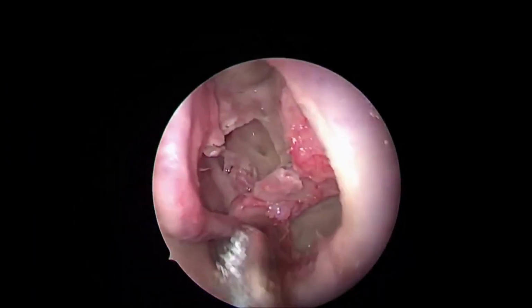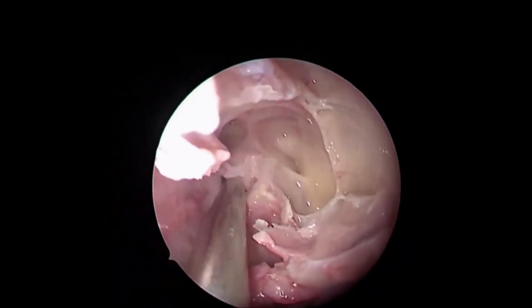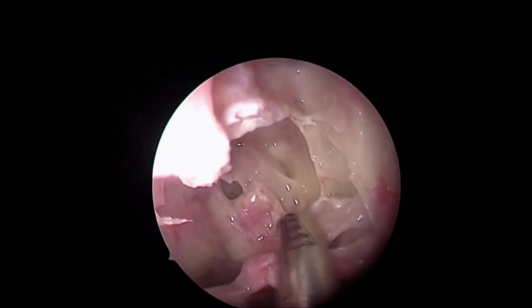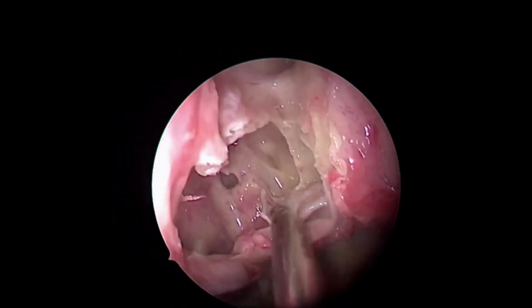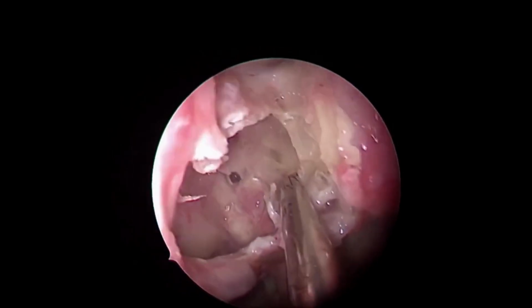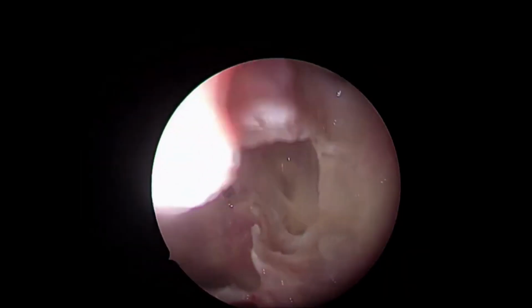Can you show us the frontoethmoidal crest, where exactly it is? Pardon? Frontoethmoidal crest in this specimen. Frontoethmoid, what is this terminology, boss? Can you elaborate? Yeah, Dr. Udbhav is asking, please ask her to show the frontoethmoidal crest. Okay, let's discuss that.